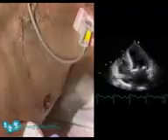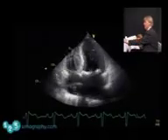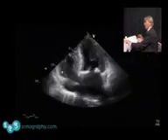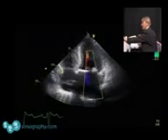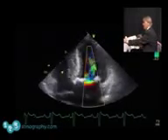And now we'll do some quantification. The first thing we'll like to look at is the mitral valve signal, the inflow signal. So we'll put the continuous wave Doppler spectrum across the valve. We can probably get a better signal if we really use the 2D color to guide us.